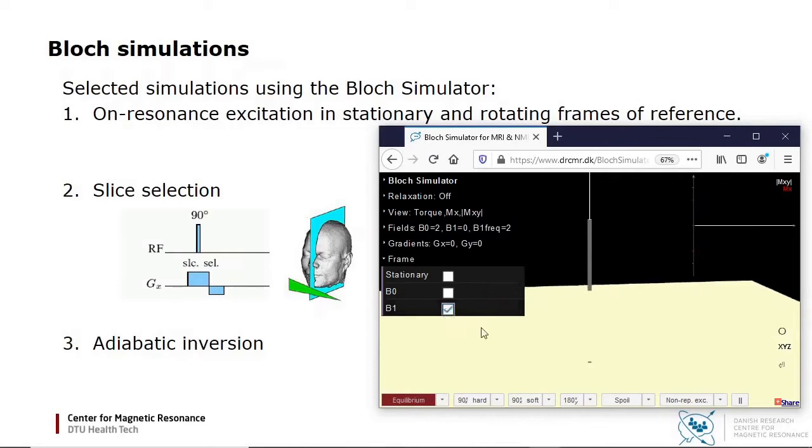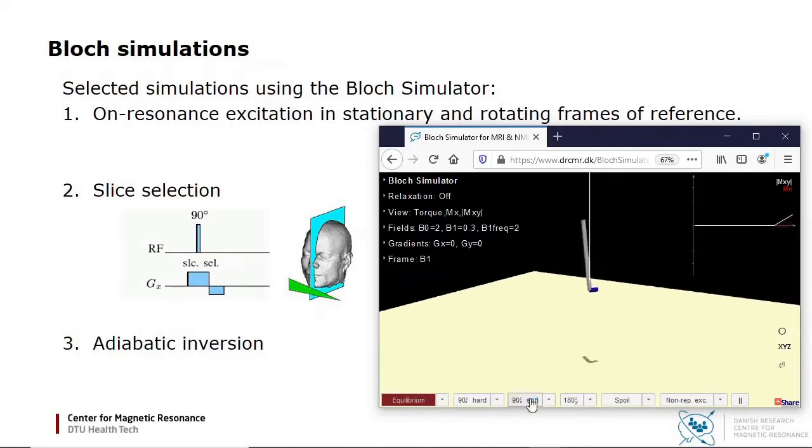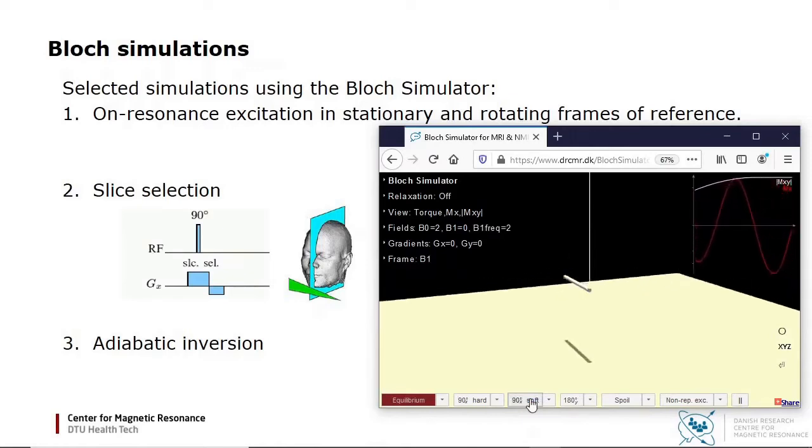Then I apply the 90 degree pulse, and you will see the effective field vector as a blue bar. You see that the magnetization precesses around the effective field vector, which is transversal, since the pulse is applied on resonance.